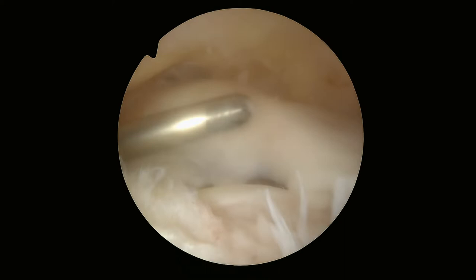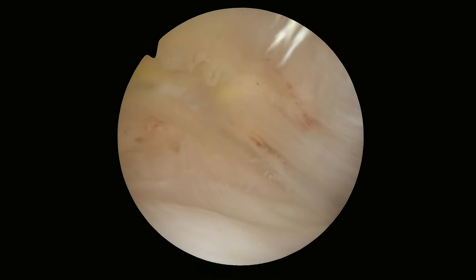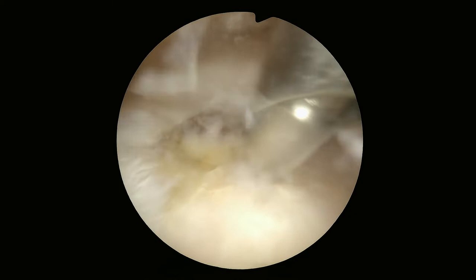That is the cuff itself. My best analogy for this is it's like blankets on your bed that are pulled down to your feet. You want to grab them off your feet and tuck them into your chin. So I'm reducing the rotator cuff, seeing how it's supposed to be. And we lightly abrade the bone to try to get good bleeding bone.